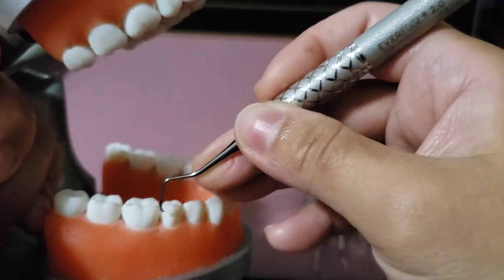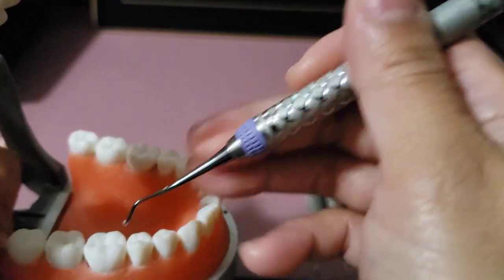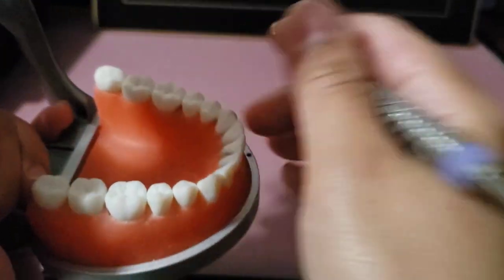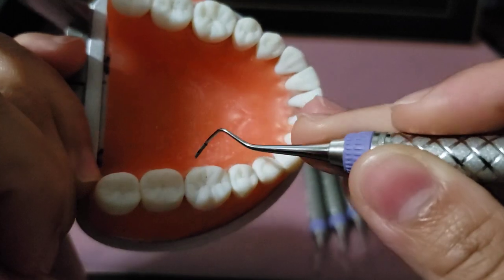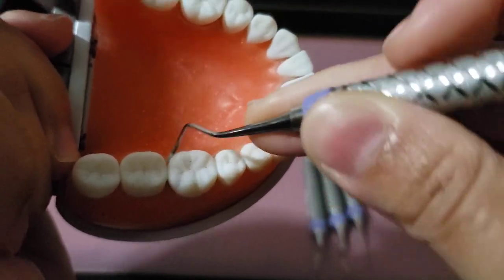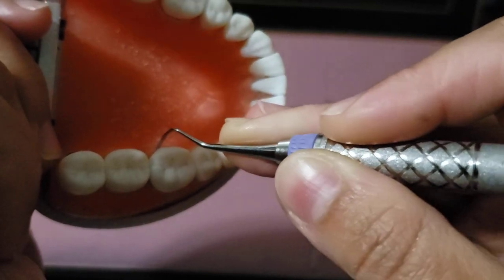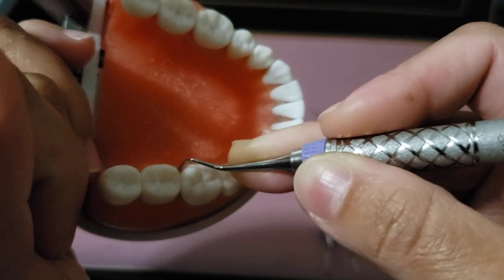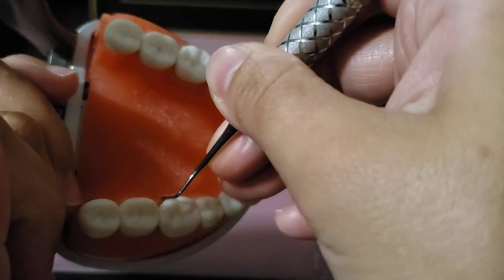Repeat the steps for the remaining posterior teeth. Remember that when working on lingual surfaces, you always flip the instrument over so that the toe is still pointing distally. Close, insert, open away, then point mesially and repeat.